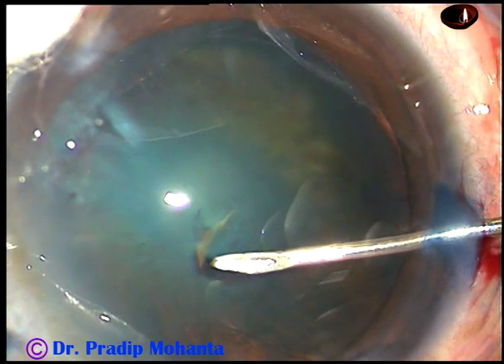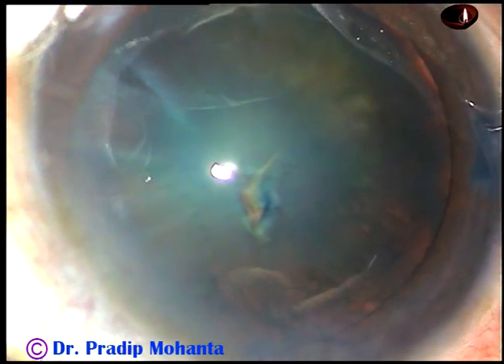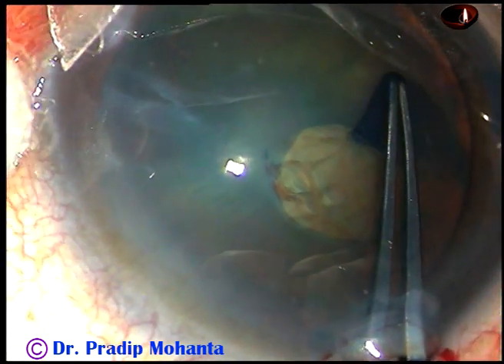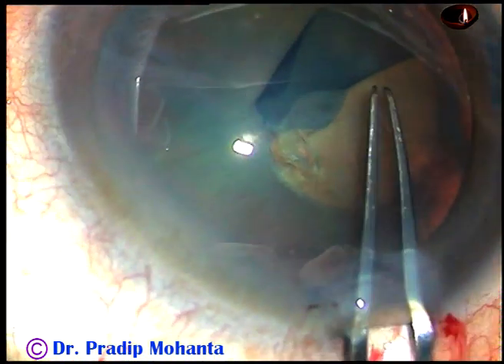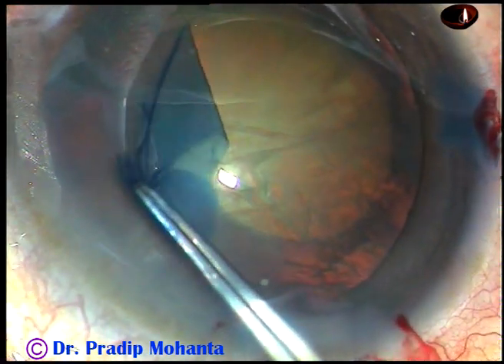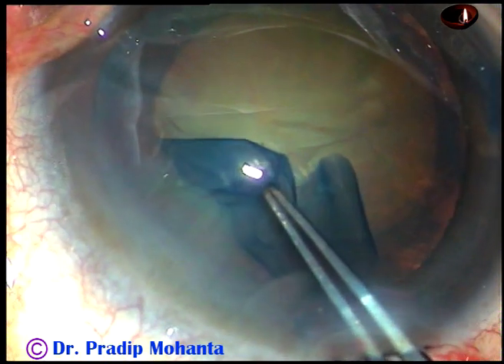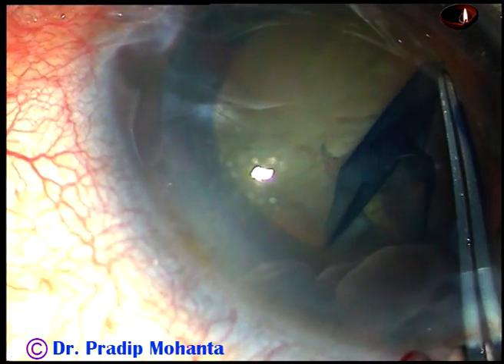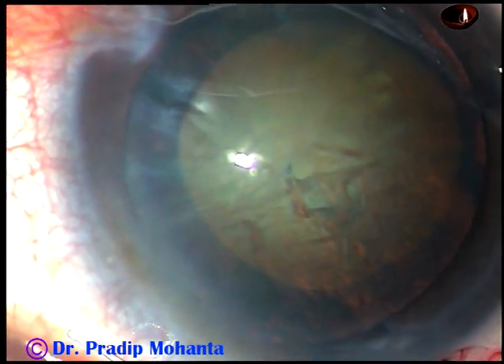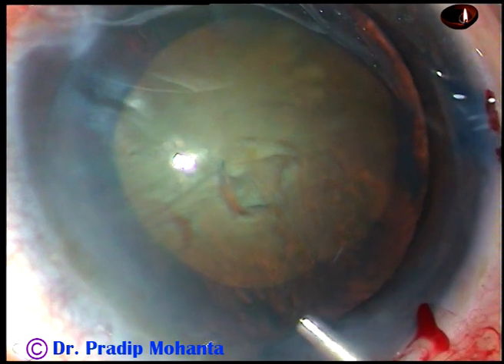In this case, after the initial steps, capsulorhexis is being done now. I incise the capsule with a 26-gauge bent needle and then take a utrata forceps. Hold the capsule, go anti-clockwise, remain at a certain distance away from the margin of the pupil. I usually prefer a rhexis towards the larger size — usually 5.5 to 6 millimeters — and then complete the rhexis.